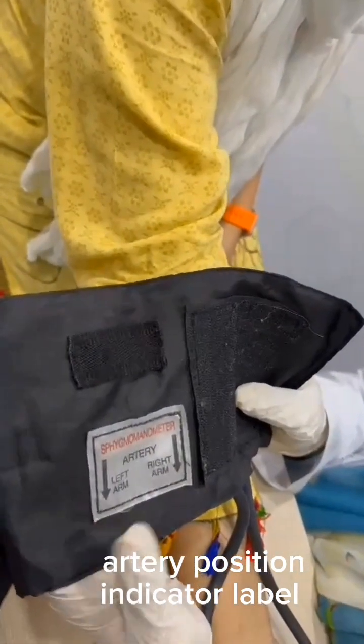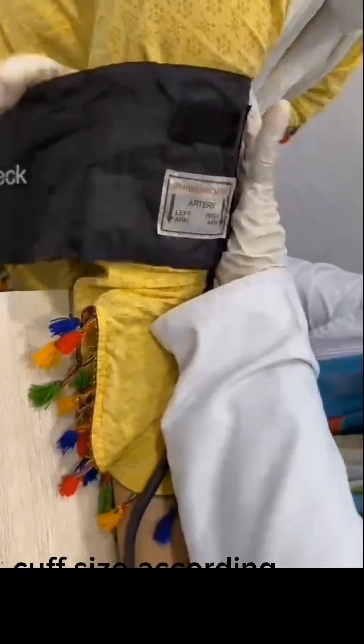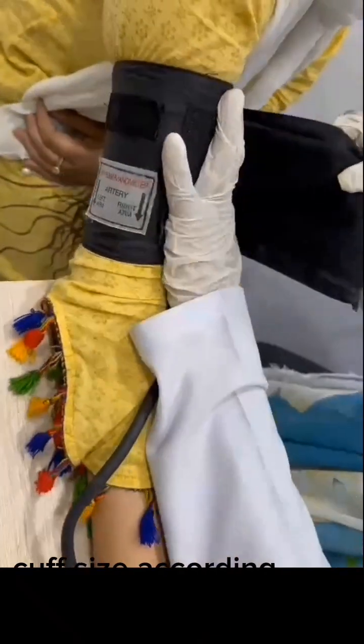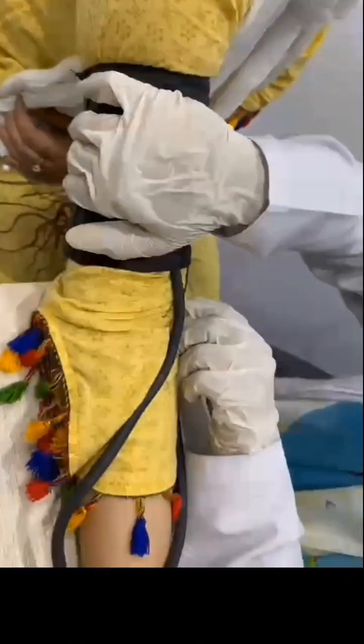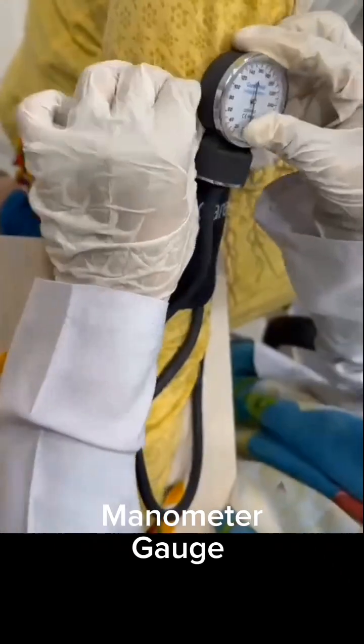Artery position indicator label. Tie the cuff around the arm tightly. Patient in sitting position, arm resting on the table. The tube connector should be placed on the ulnar side, which is the little finger side.